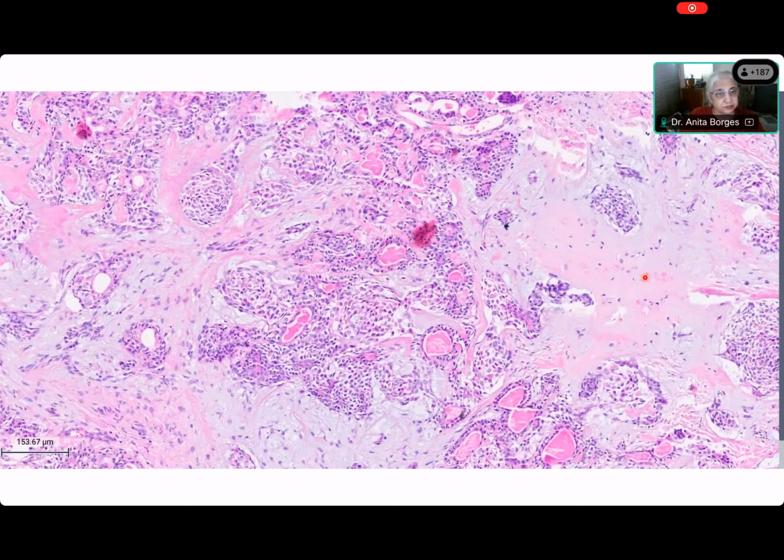Come on, Madhu. That's mixochondroid, which we saw. Excellent. Anything else? What else are you seeing here? Because all of them are pointing in one direction. Myoepithelial cells. Yes, myoepithelial. It is pointing in the direction of myoepithelial cells. But to know that there are myoepithelial cells, you have to recognize the features of myoepithelial cells in tumors. So don't tell me myoepithelial cells. What are those features?